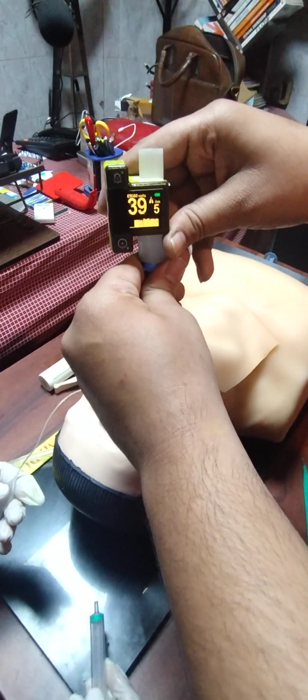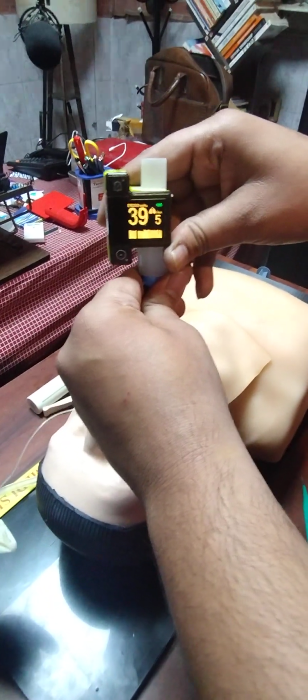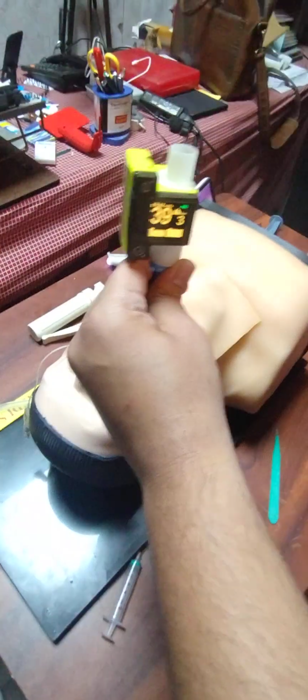So now you can see the ETCO2, the number is 39, so we are well inside the trachea, and just to demonstrate further, now we can see from here also. So this is our tube. Okay, so we have successfully intubated with our straight blade laryngoscope.